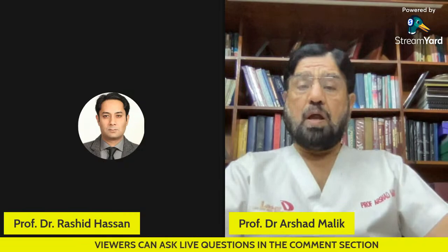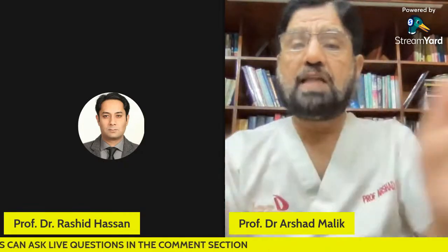Then the erbium YAG, then the Nd:YAG laser. We have different devices to evaporate, to cut, to coagulate. These are such beautiful instruments that we can achieve coagulation of any vessel of 0.5 mm. Especially when we are going into the oral cavity, it is an astonishing result. In the oral cavity we have teeth, and soft tissue like the tongue, palate, cheek, lips, and the floor of the mouth. Whether hard tissue or soft tissue, we can keep all these in mind and have the better biological effect as well as the heat-related effect of the laser.